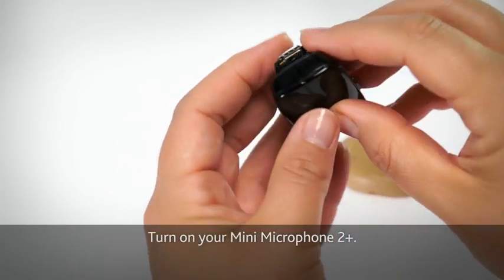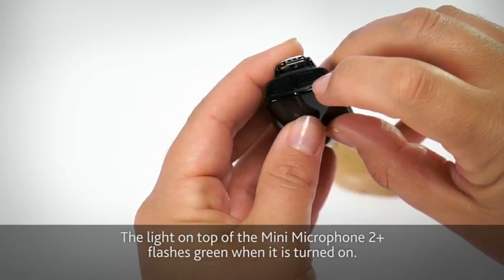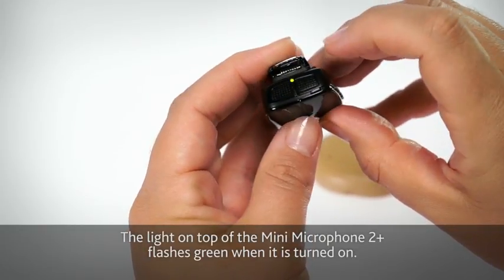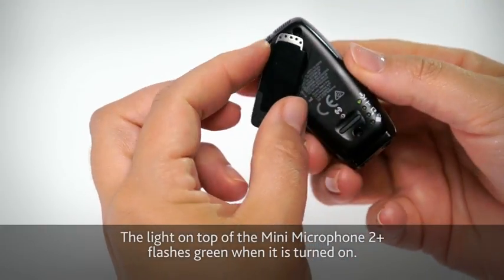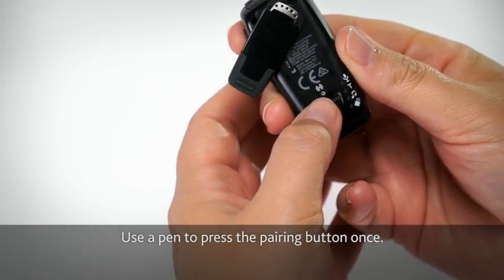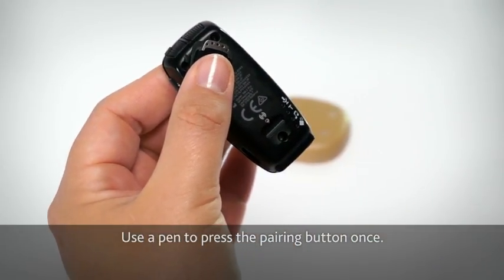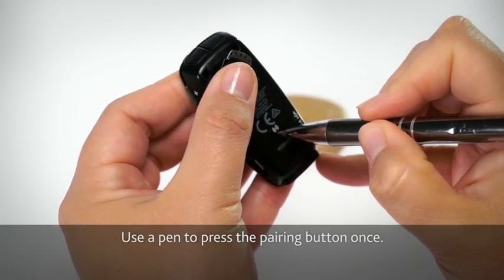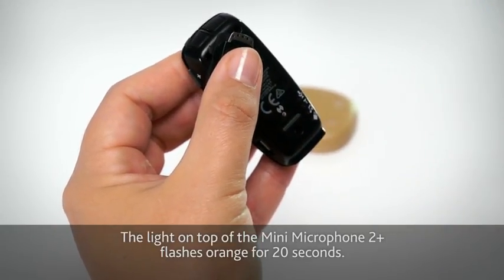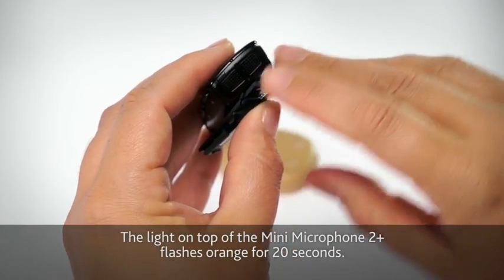Turn on your Mini Microphone 2 Plus. The light on top of the Mini Microphone 2 Plus flashes green when it's turned on. Use a pen to press the pairing button once. The light on top of the Mini Microphone 2 Plus flashes orange for 20 seconds.